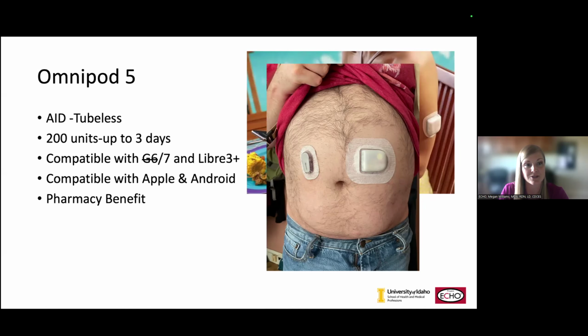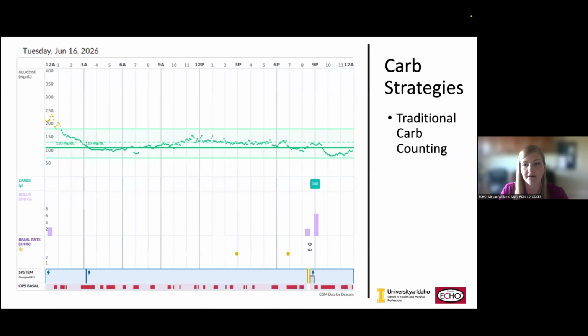Someone from that company should get a gold star for figuring out how to manage that, because it is not considered an insulin pump. It's an insulin delivery system, which makes it so much more accessible and affordable for patients and less hair pulling for providers who have to jump through hoops of C-peptides and all these other things to get durable medical equipment covered.